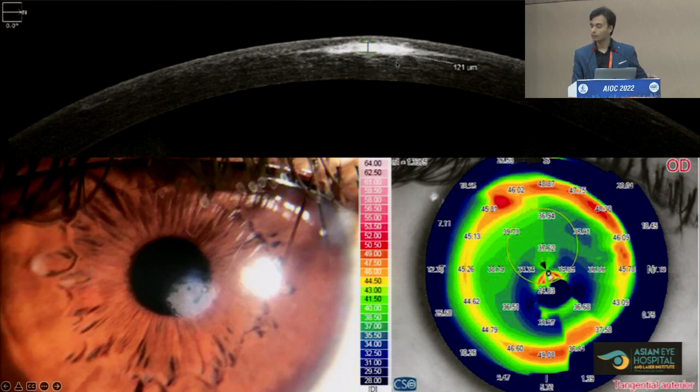In this case, this was more of an implantation kind of epithelial ingrowth, in which, if the epithelium surrounding the incision is loose, there is a chance that while dissecting the lenticule, the epithelium has slid inside. That is when you have an isolated epithelial ingrowth. This is a very good question, because that also decides how you are going to approach this case, since it completely differs in this scenario.